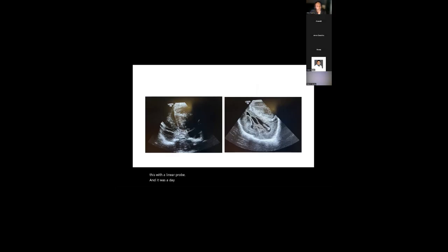What I felt is that, obviously my gain is very high, but there is a bleed here with a midline shift, spotting the ventricles. So this is the right ventricle and this is the left ventricle. This is the cavum septum pellucidum. Again, it is not clear exactly what it is, but you can see brightness all over. It's a brilliant image.